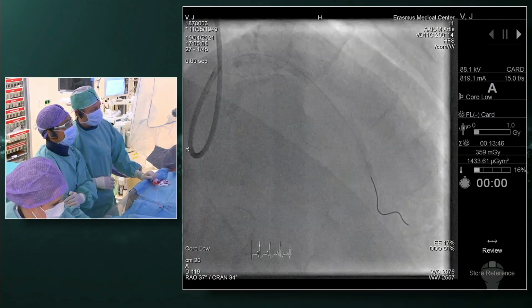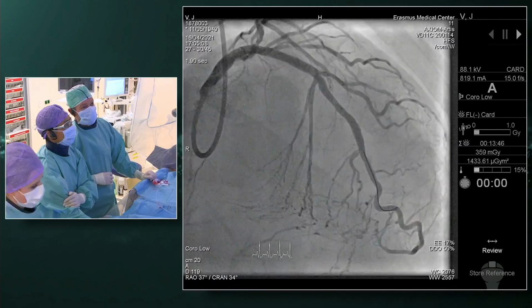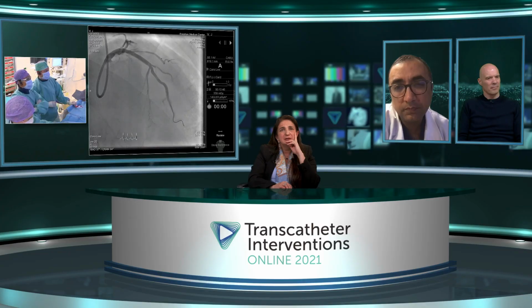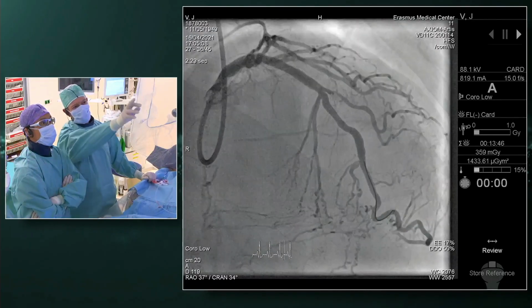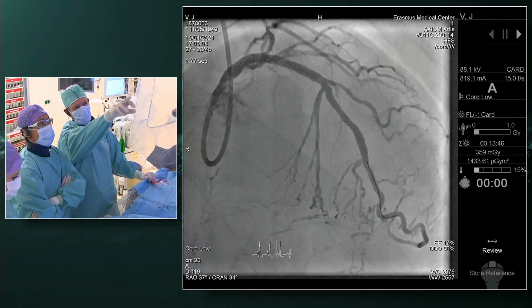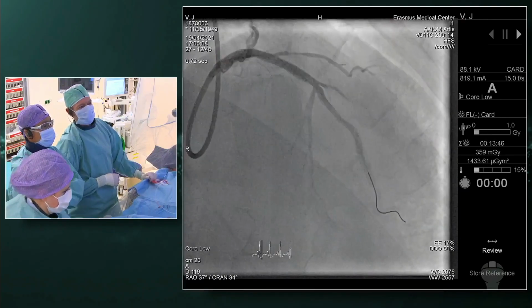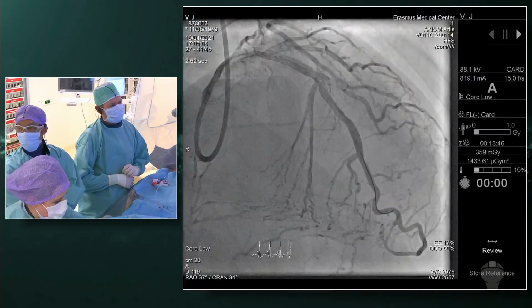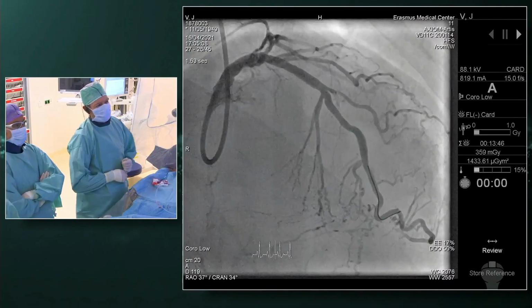So this is the final angiogram. Angiogram, beautiful. Yeah, that's definitely exactly what we intended to do, the stent down distally. Yeah, so there is a small, maybe you cannot appreciate it that well, but before the very small diagonal at the tip of the radiopaque part, there is something I don't trust very much. So I'm not sure I want to be even more aggressive here. On the IVUS, we don't see any hematomas or ruptures, but it could be a very small covered perforation.